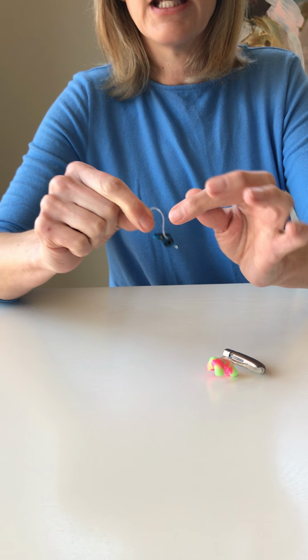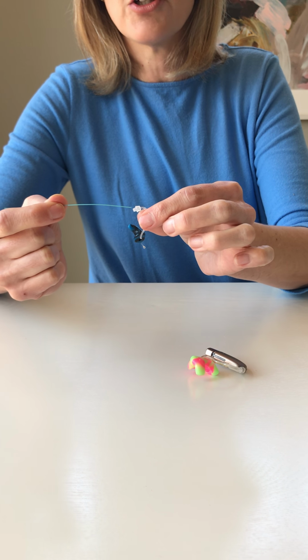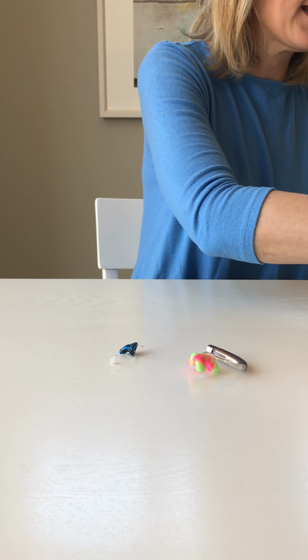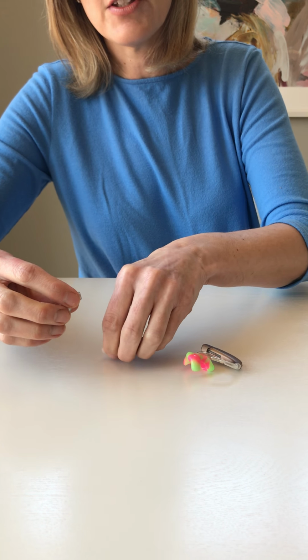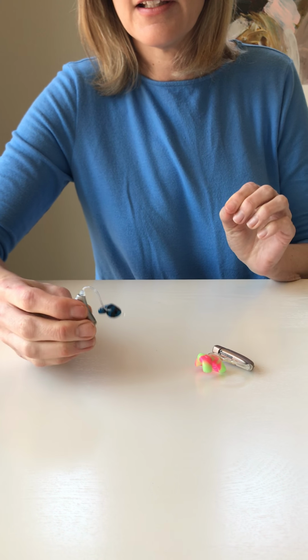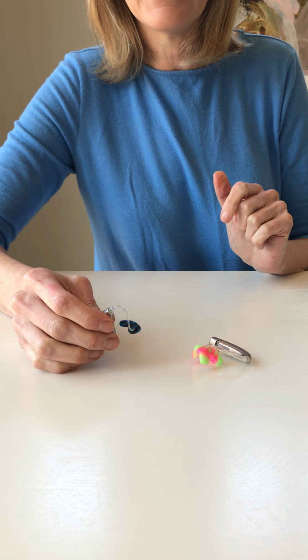If I do hear it working, then I can either try and clean that slim tube with one of these little pipe cleaners that you should have at home, or I could simply replace that entire piece with a new slim tube on the end. And you simply screw them on righty-tighty, lefty-loosey, just like any other screw goes on. And then hopefully you have a working hearing aid again and you're ready to go.